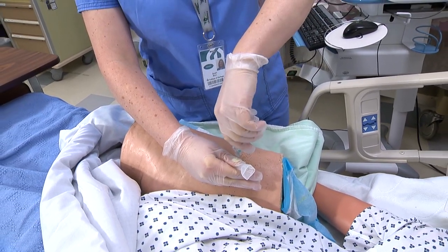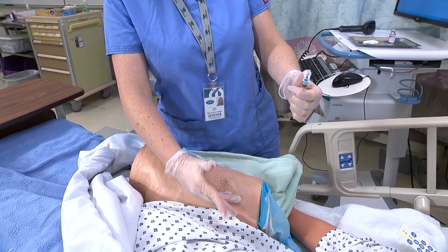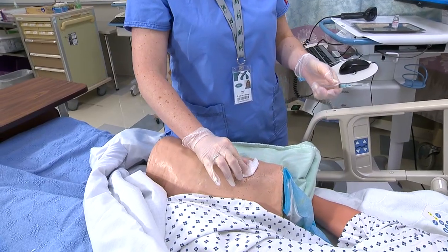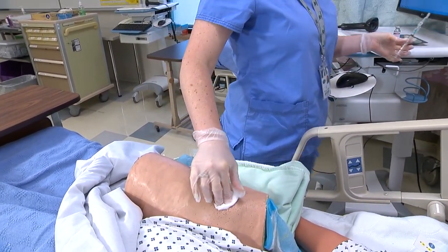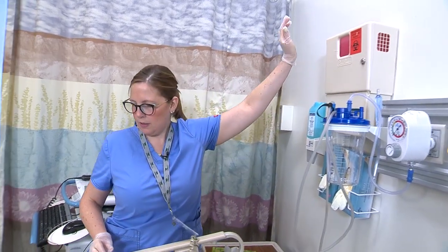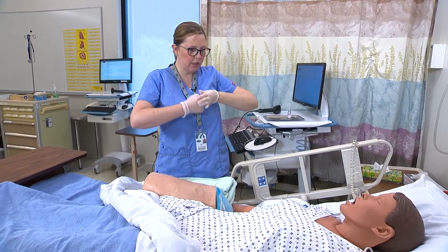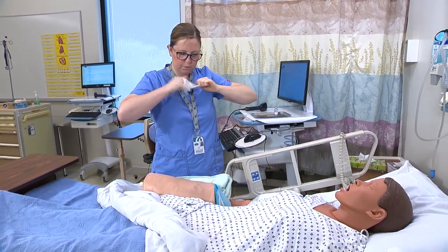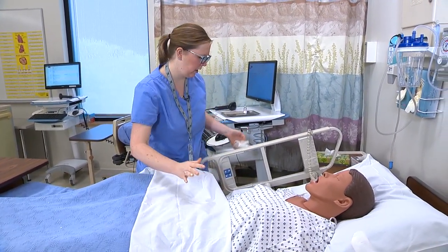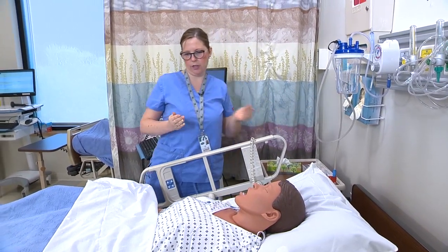I'm going to inject the medication, hold it there, then remove the needle and engage my safety. I'm going to apply gauze, then put my needle in the sharps box. Okay Morgan, that's it. You might have some soreness for a day or so. I will come back and check on you to make sure you had no reaction and check the area for any redness or inflammation.